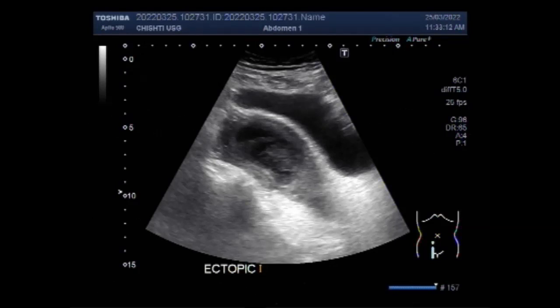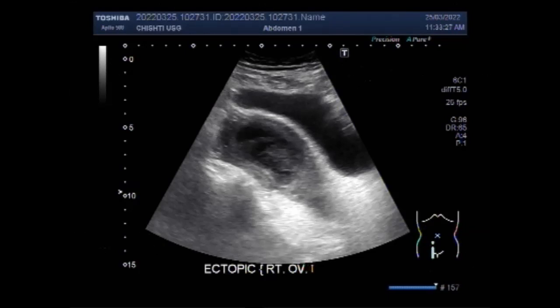Just one to two percent of all pregnancies are ectopic, and in 95 percent of these cases the egg is fertilized in the fallopian tube on its way to the uterus. In half of the remaining cases, including this one, the baby grows inside the ovary itself.